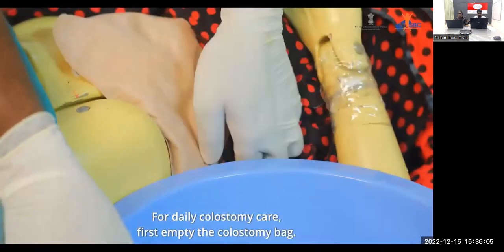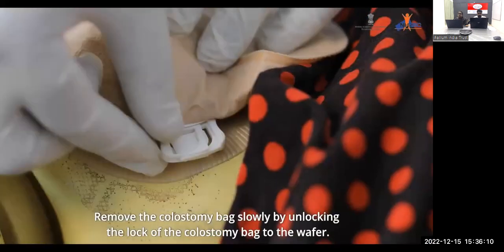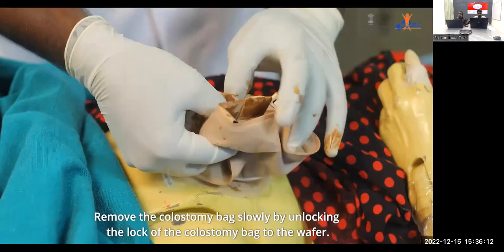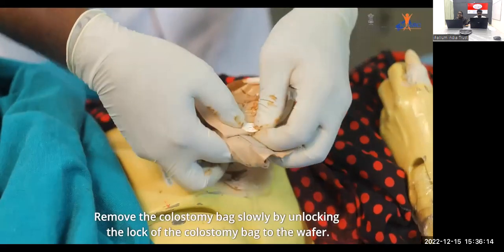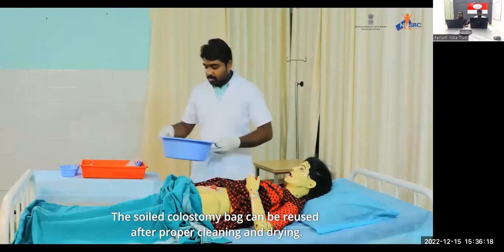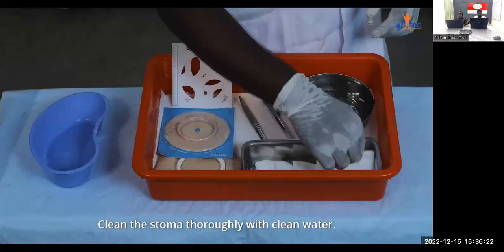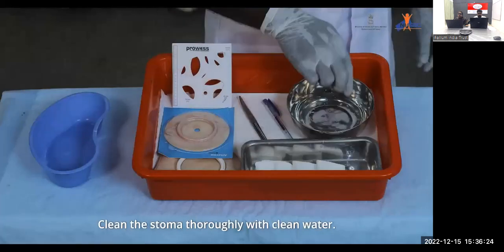For daily colostomy care, first empty the colostomy bag. Remove the colostomy bag slowly by unlocking the lock of the colostomy bag to the wafer. The soiled colostomy bag can be reused after proper cleaning and drying. Clean the stoma thoroughly with clean water.